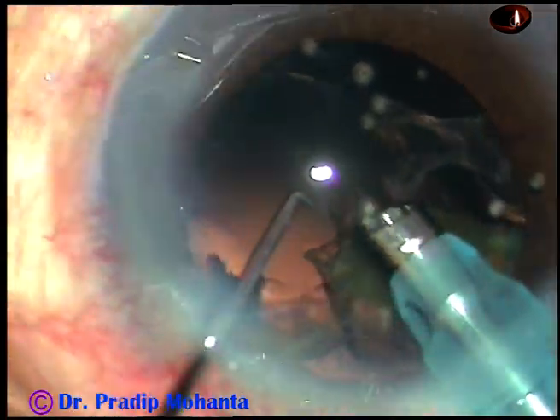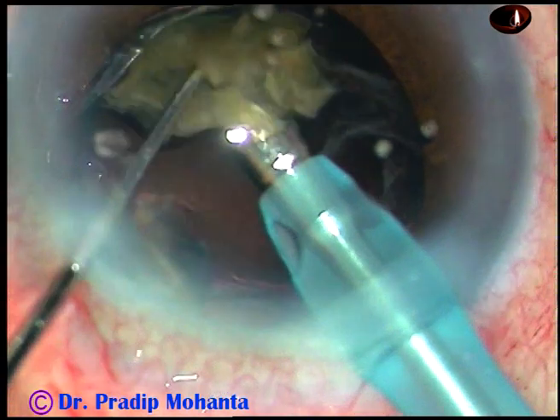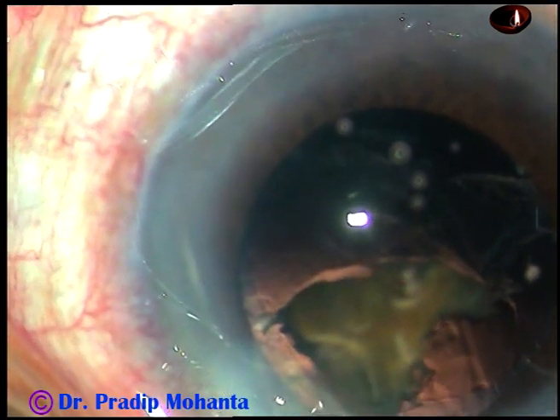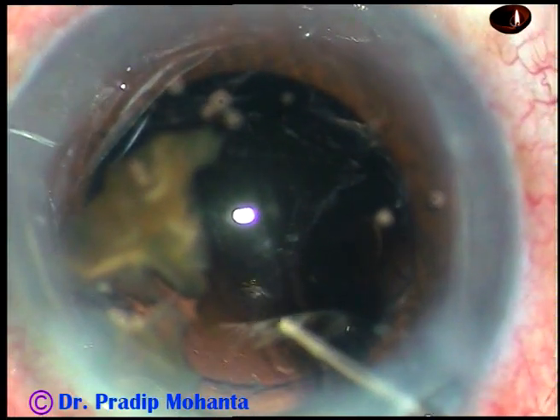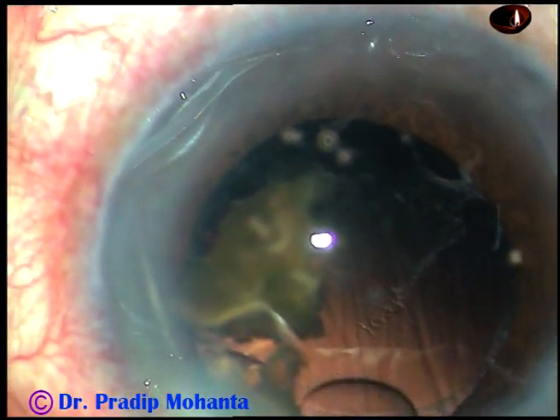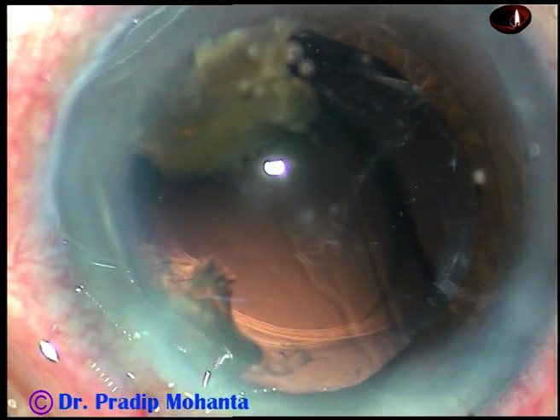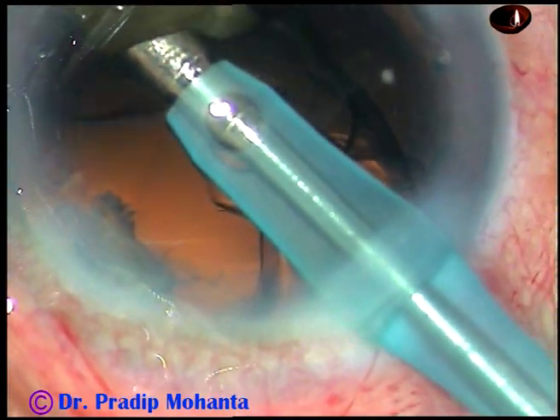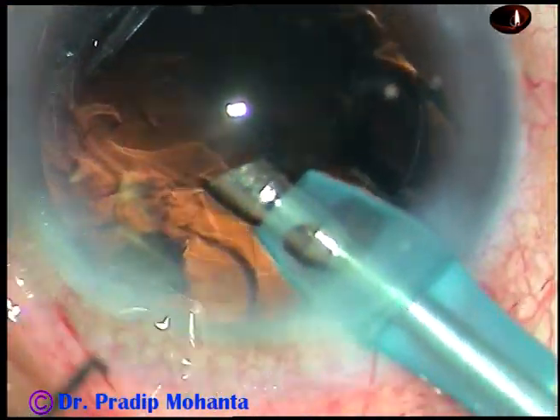This is the last portion of the nucleus. You can see there is no epinucleus — everything is a huge nucleus. I come out and want to use a visco cushion since there is no epinucleus. I inject Viscoat, pushing the posterior capsule towards the vitreous cavity, and this is HPMC. Now I am going to use the phaco tip again, hold the nucleus in HPMC, and emulsify it. Here is another small piece of nucleus, and it gets emulsified and removed.